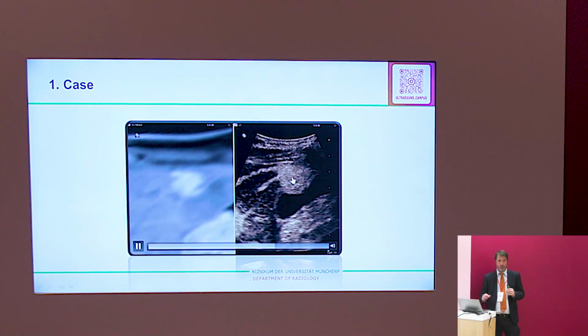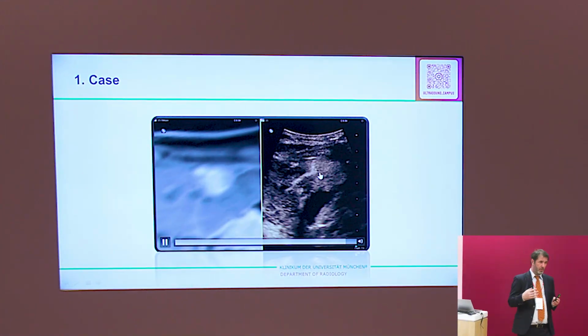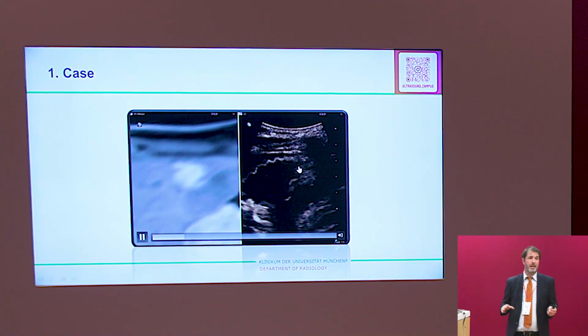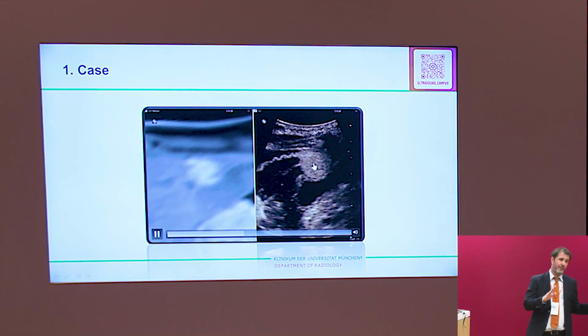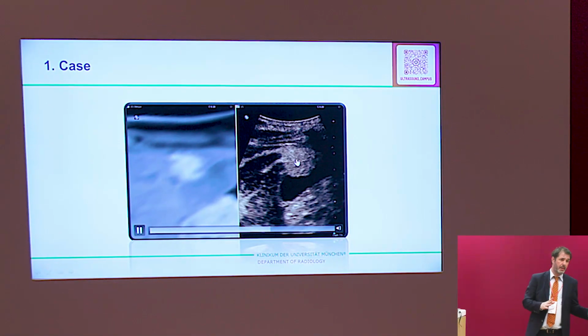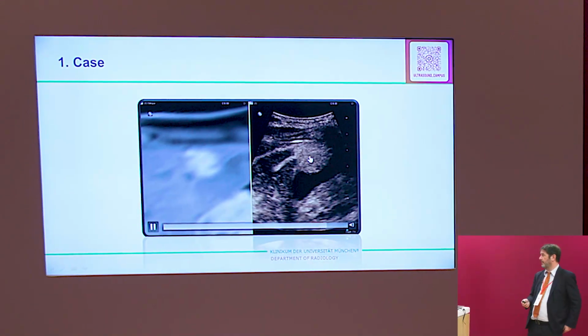This lesion shows strong uptake from the center to the periphery. And due to the fact that this lesion has no washout later, we know exactly, we could confirm the diagnosis of the MRI. It's just an FNH. Sometimes even a benign lesion could compress something, but there is no risk of cancer in this case.